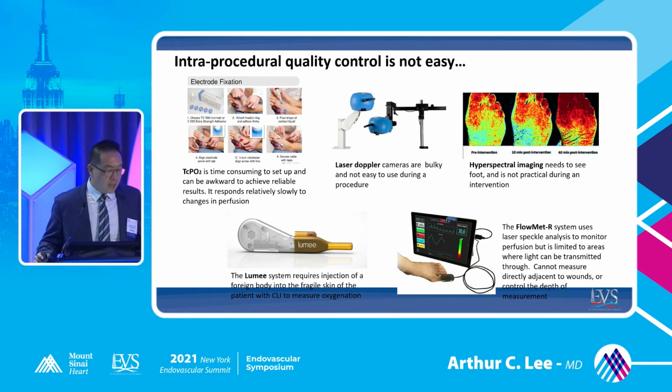Hyperspectral imaging is nice because it's non-invasive, but it takes time. So you can see the pre-intervention, post-intervention image in the middle, but it takes 60 minutes for it to really catch up. And that's not practical on the table.